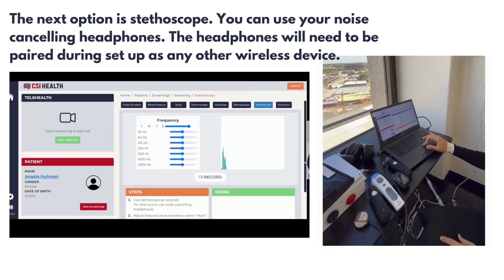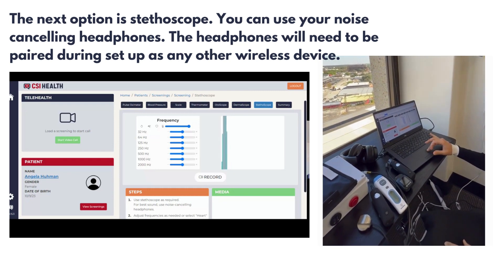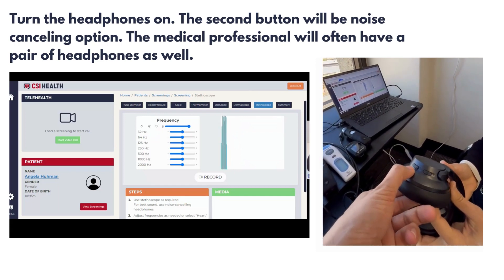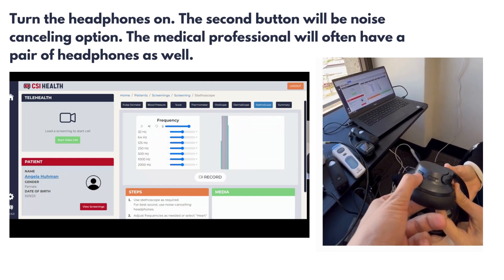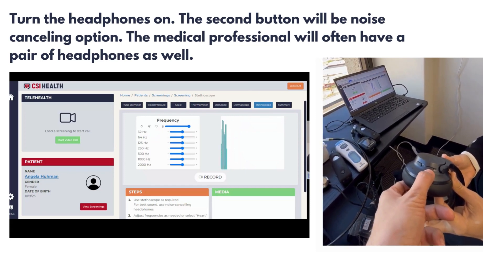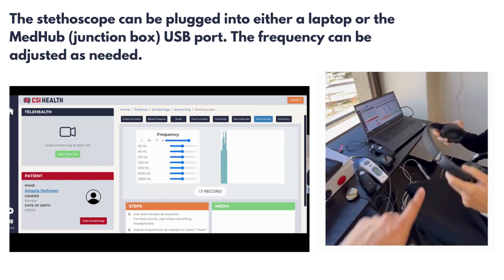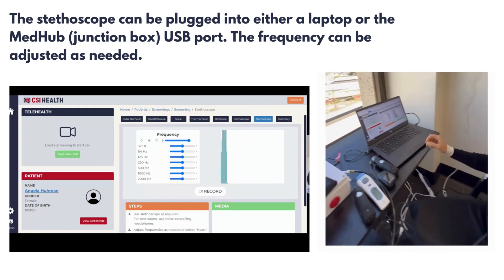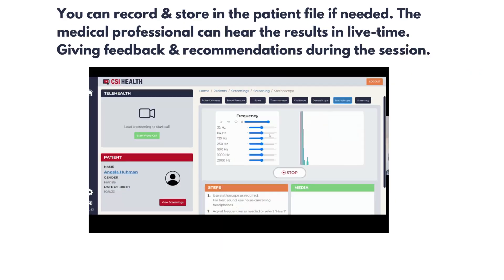The next option is the stethoscope. You can use the noise-canceling headphones, which will need to be paired during the setup phase like any other wireless device. Turn the headphones on — the second button is the noise-canceling option. The medical professional will often have a pair of headphones as well. Note that the frequency buttons along the side can be changed and adjusted. You can record and store audio in the patient file if needed. The medical professional can hear the results in live time, giving feedback and recommendations during the session.